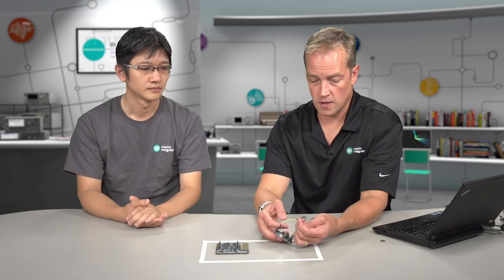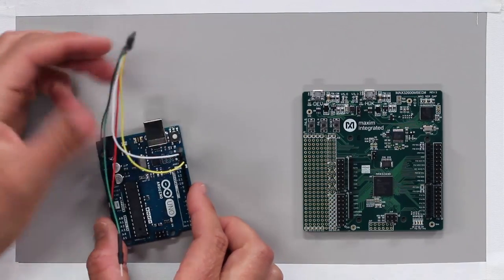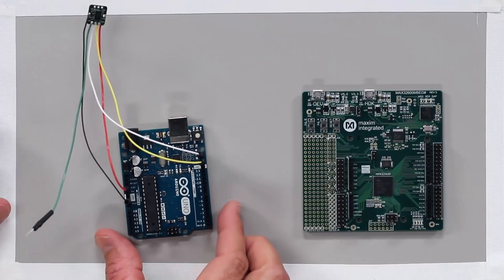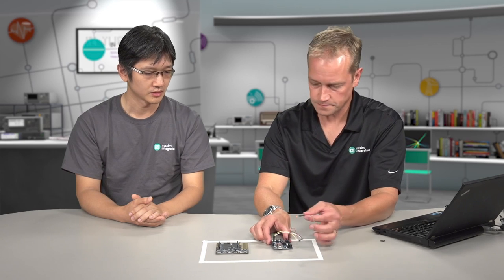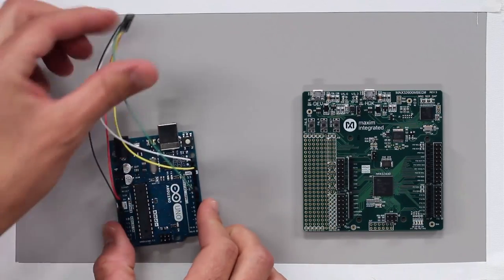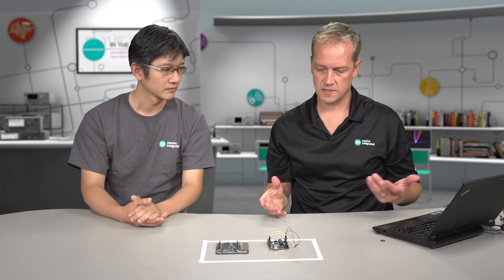And let's see, I put my SDA line in there on the Arduino board. I'm sorry if the view isn't great. Once I get these lines in, I'll back off a little bit and hopefully you can get a good overhead view. Does that get a good view, guys? We got it. And then this last line, the interrupt, goes into pin 10, right? Pin 10, yes. Let me make sure that's in there. And that's how you wire it up. It's that simple, right? Yes. Okay, awesome. So then let's go ahead and wire this up to the computer and get it going.